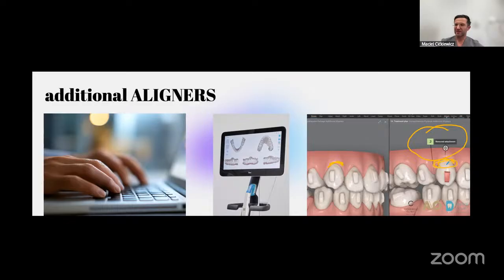So in this case it was necessary to create a new one, because the problem appears during the animations and the plan, because you can see that it's very close, that sometimes the incision for the elastics is too close to another attachment.